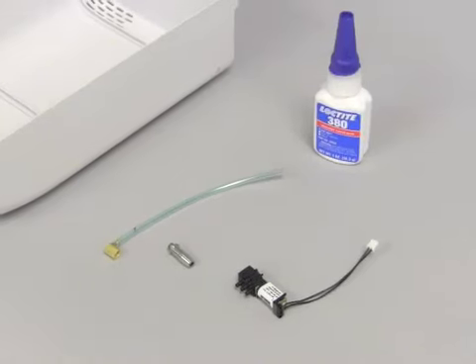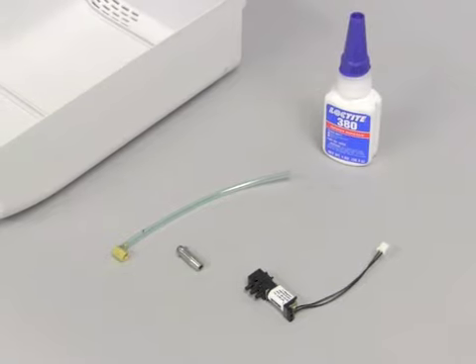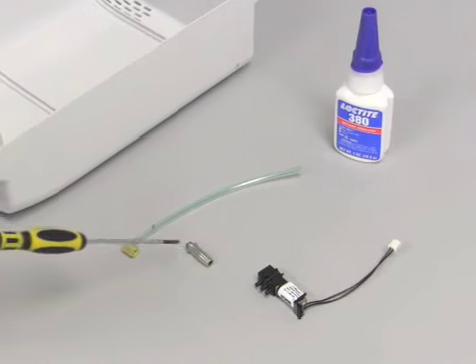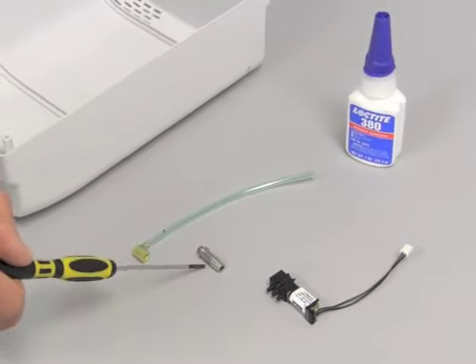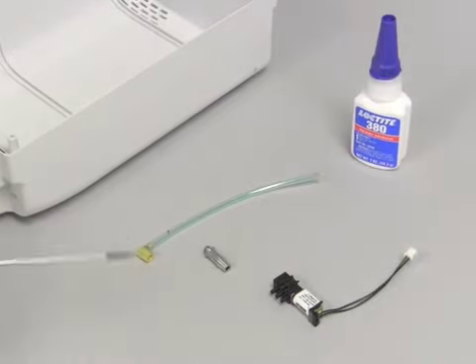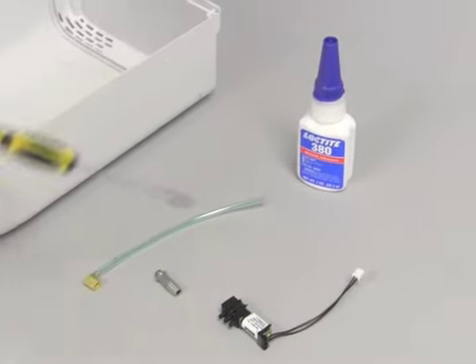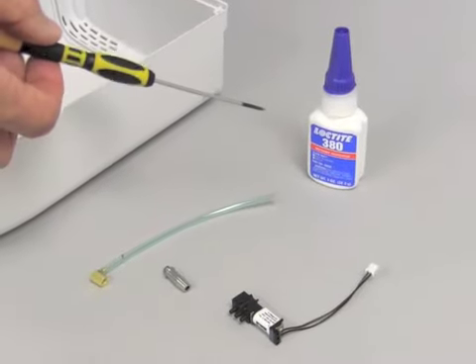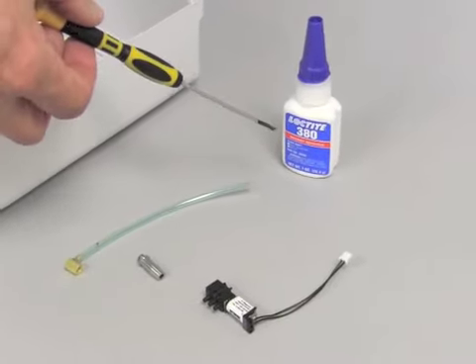The next step is to reassemble the POC, and the first thing we'll do is to add the new 3-way valve, and then reinstall the hose barb into the fitting and the Tygon tubing. What I point out here is that when you attach the hose barb to the fitting, you need to use 1 drop of 380 Loctite.